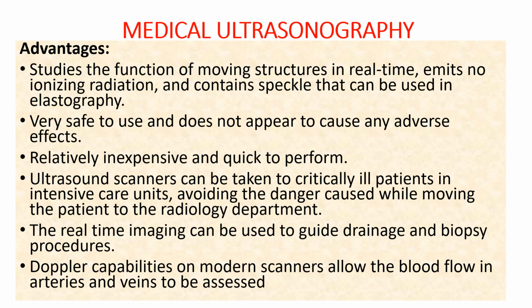Ultrasound scanners can be taken to critically ill patients in intensive care units, avoiding the danger caused while moving the patient to the radiology department if he cannot be taken there. So it is highly portable. The real-time ability of ultrasound in imaging can be used to guide drainage and biopsy procedures. Doppler capabilities on modern scanners allow the blood flow in arteries and veins to be assessed.